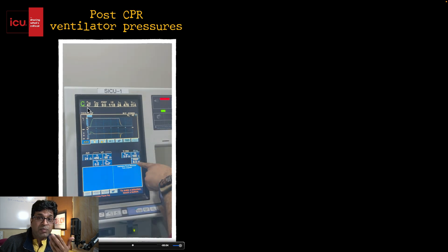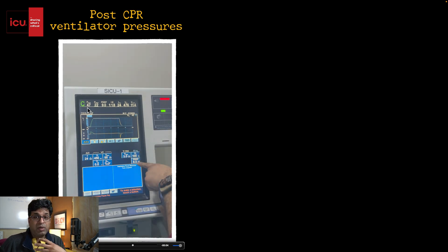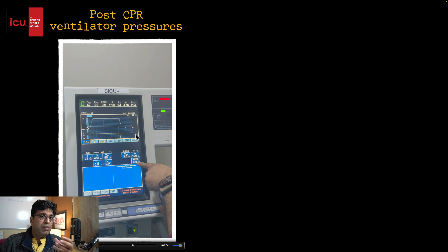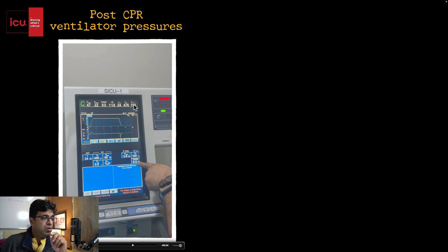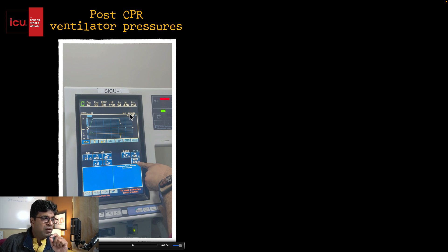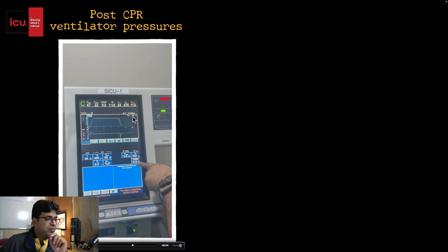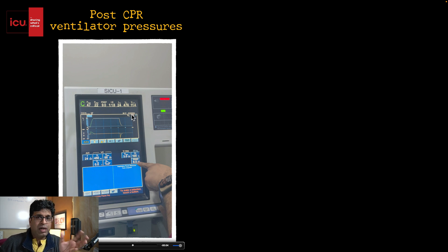We pressed the inspiratory pause button on the ventilator. You can see there is a pause in inspiration. The peak is 47 and the plateau pressure (P-plat) is 42. So out of 47, 42 is plateau pressure — meaning the elevated pressure is predominantly coming from the parenchyma due to pleural effusion and pulmonary edema. However, our experience tells us that in pulmonary edema or cardiac failure alone, plateau pressure doesn't usually go this high unless ARDS is also present.